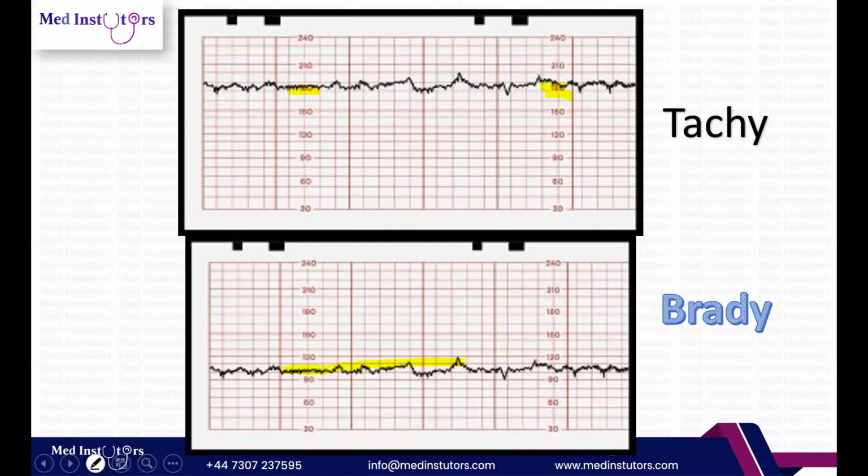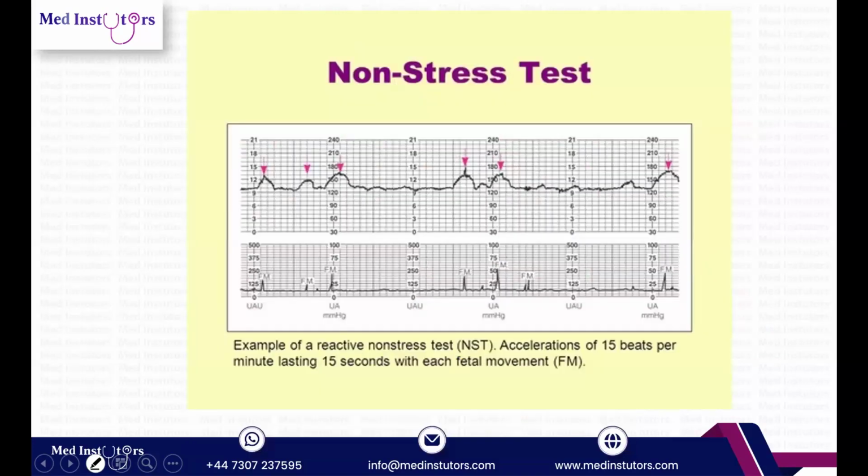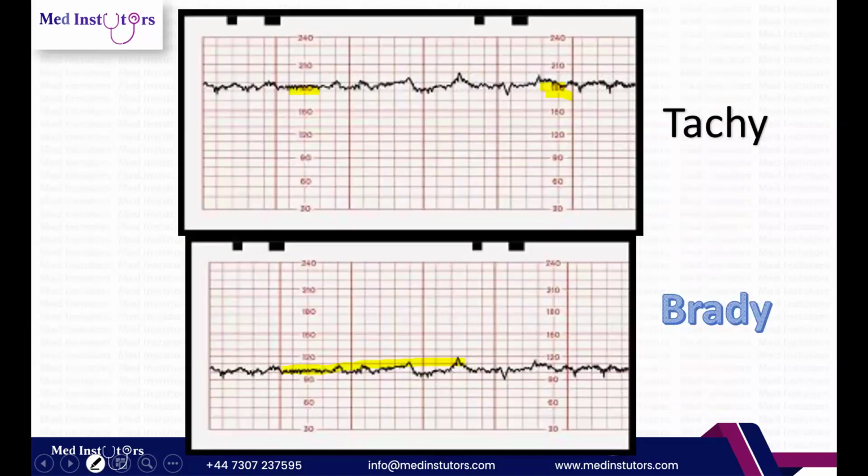So whenever we read, we first look at the contractions. Now here, obviously the contractions are not given. Here the contractions were given, so they are fine. It's not 90, 90 is here. It's just above 90, so it's around 100. So we looked at the contractions, then we looked at the fetal baseline.